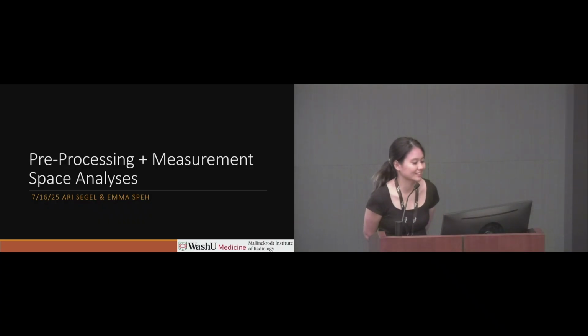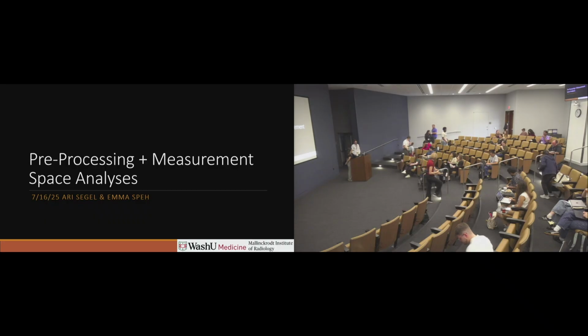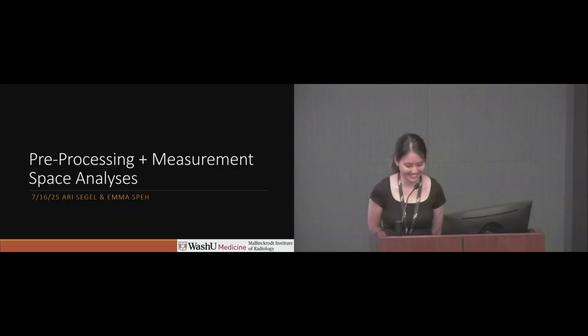So next speaker is Ari. He's gonna walk us through pre-processing in measurement space analyses. You'll hear more about reconstruction, I think, later. No? Okay, no. Model generation. Model generation later, yes. Okay, perfect. So let's go ahead and get started.